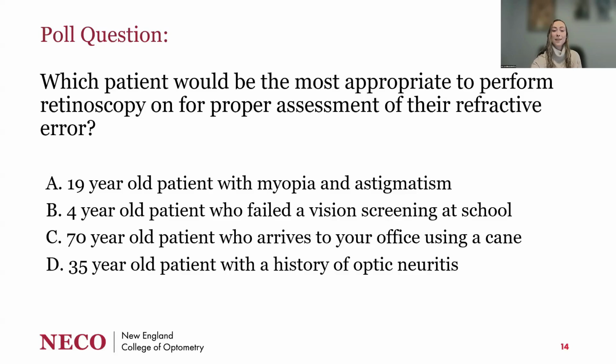Great. We have 83% agreeing that the 4-year-old patient who failed the vision screening at school would best benefit from retinoscopy. Our pediatric patients are incredible subjects for retinoscopy. It's very difficult to get accurate subjective responses from them, and retinoscopy following a cycloplegic refraction is the gold standard to get the best glasses prescription for our patients.